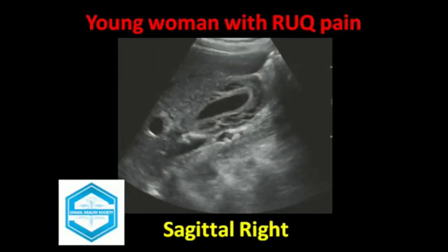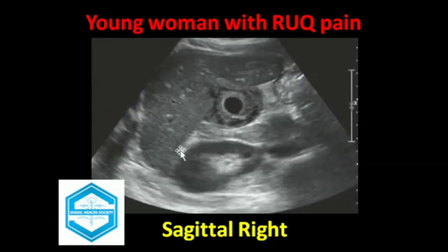This image belongs to a young woman of 30 years of age with localized pain in the right upper quadrant. On sagittal images, there is a thick-walled gallbladder with edema evident clearly on this image. The second image also shows the transverse section of the gallbladder, with an edematous thick-walled gallbladder surrounded by a very thin hypoechoic area suggestive of edema.